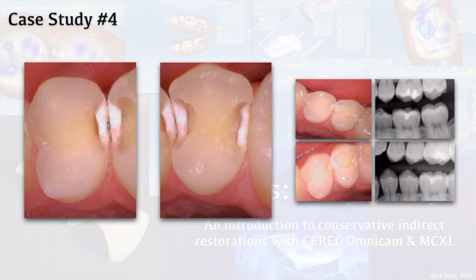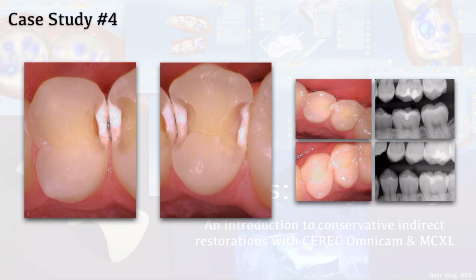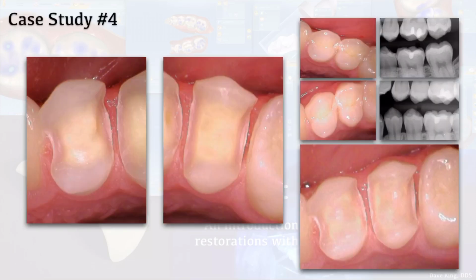But that goes to show you, taking pictures like this during the procedure really helps the patient to see what's going on, because intraorally they look perfect. I mean, unless you really look at that spot, you can't really see anything. So being able to compare, oh my gosh, this is what you look like and this is what's actually going on in there. These patients, it really helps to educate them. And I offer to give them these photos. Take this photo home, show it to your mom or your dad or your girlfriend or whatever. And then that can be something that markets itself for you.